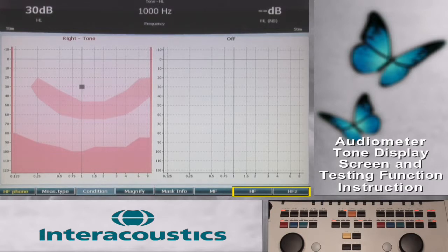If the device was purchased without the high frequency upgrade, these function key labels are blank.